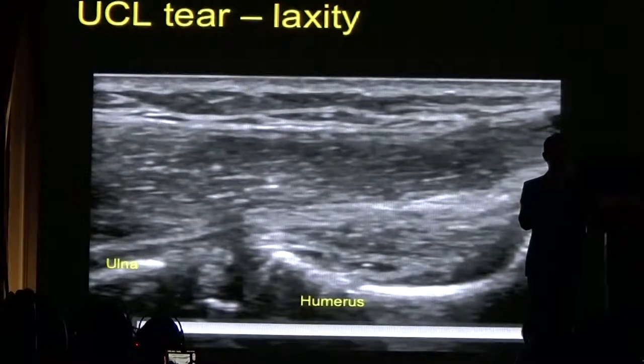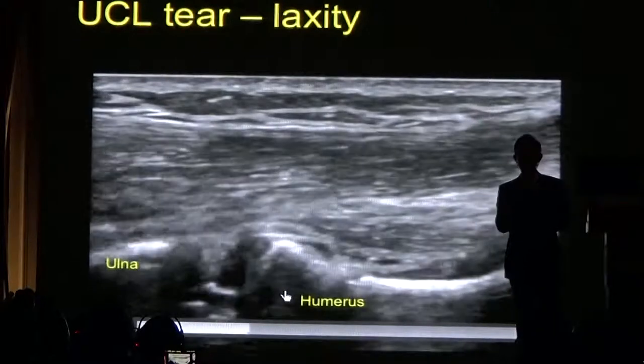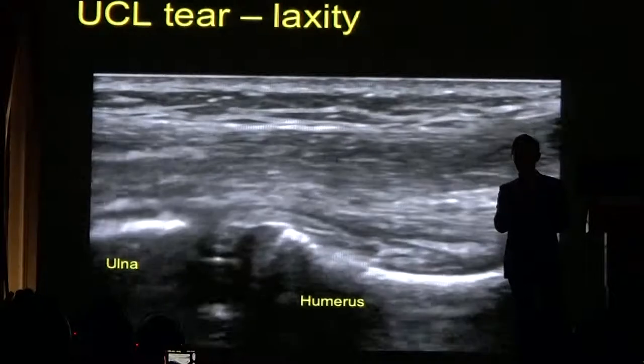Ultrasound also allows us to examine the elbow dynamically. Because the ligament is damaged, the joint widens when we stress it — this is information which we cannot obtain from an MRI scan. Ultrasound is very good for examining joints because of this ability to examine dynamically.